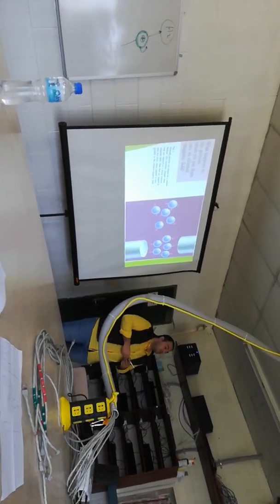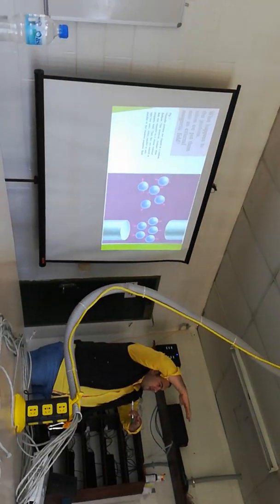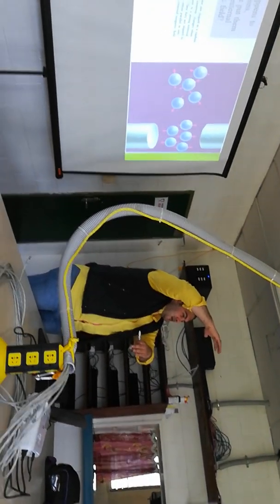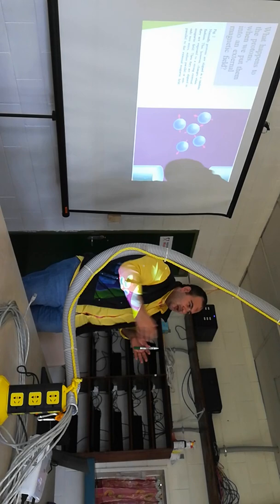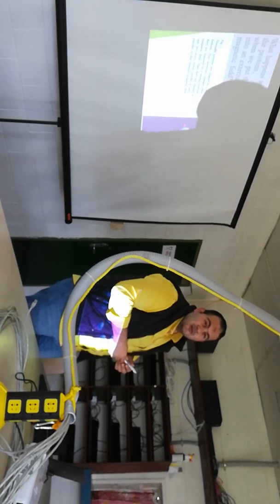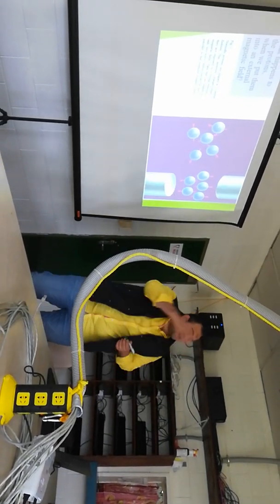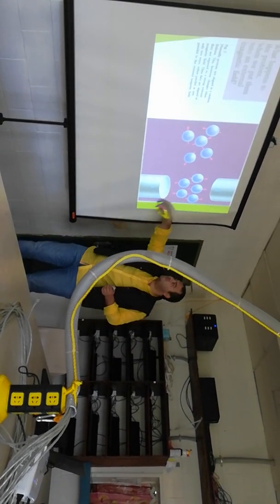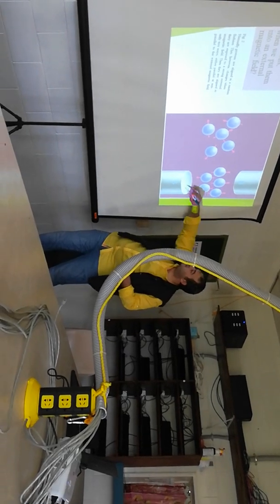All of us went to see the magnetic machine, the MRI machine, yes? Like two discs, yes? One up and another one down, yes? These are the two poles of the magnetic field, south and north. Okay? So, in between, if you put any metals, it will be attracted. Yes or no? Yes. Why? Because there are magnetic field lines from south to north. These lines of magnetic field, this is the direction of the magnetic field.